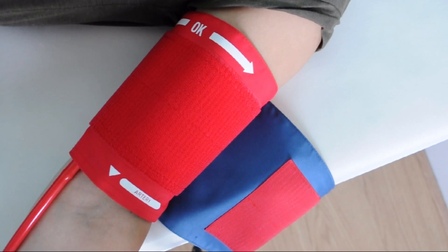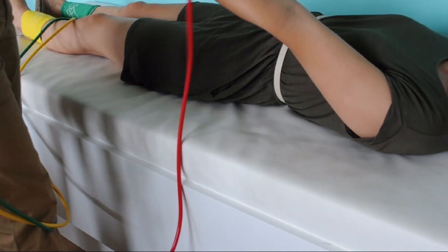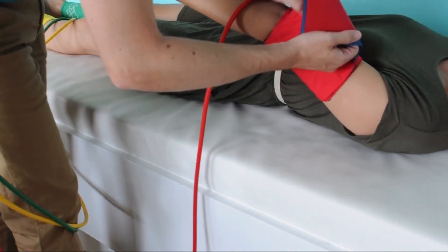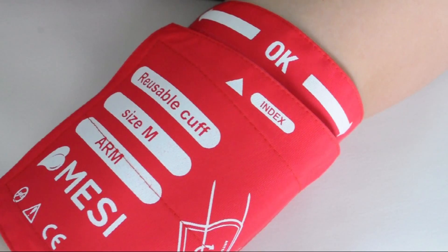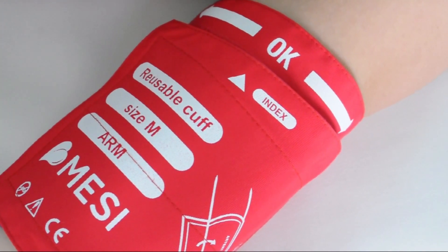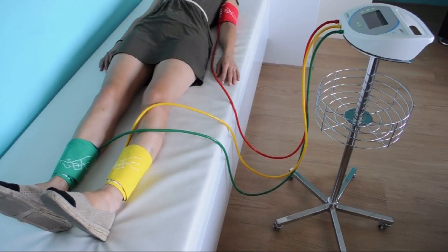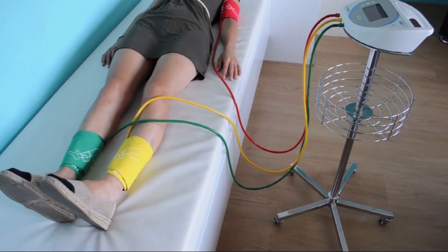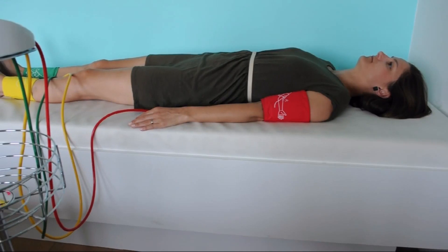Place the red cuff on an arm, aligning the arrow indicator with the artery. There is a size indicator that tells you whether the cuff is the right size for the patient, or if you have to use a bigger or smaller cuff. It is also important that the cuffs' tubes are straightened and not twisted before you start the measurement. Instruct the patient to relax and to remain quiet.